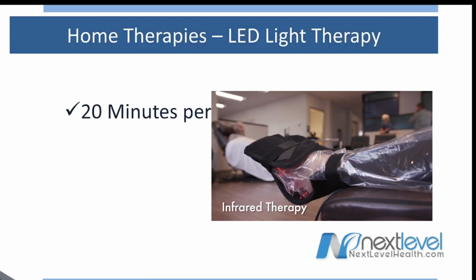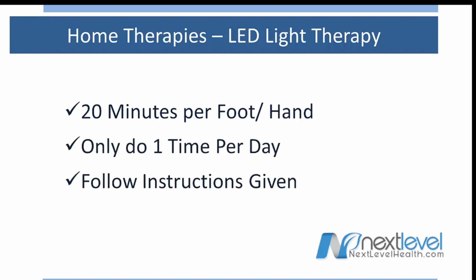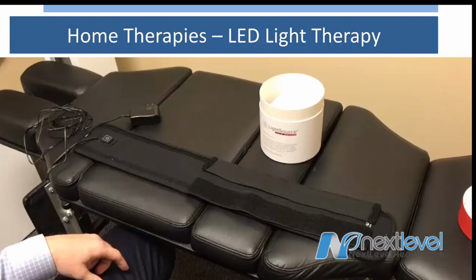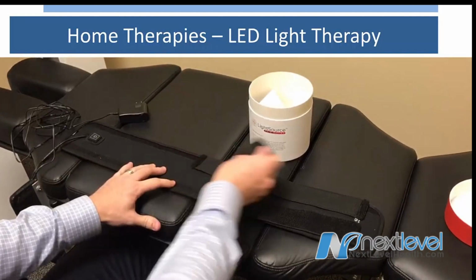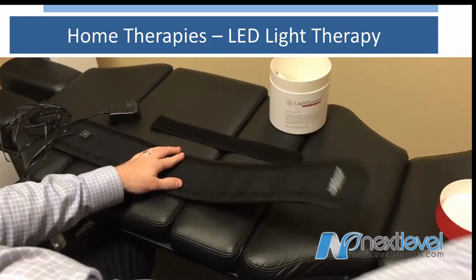It's going to be set for 20 minutes and it will run on an automatic timer. Only do it one time per day. Follow the instructions that we will give you. Once you remove the light unit from the box, flip the light unit over and remove the 2 Velcro straps located on the back.